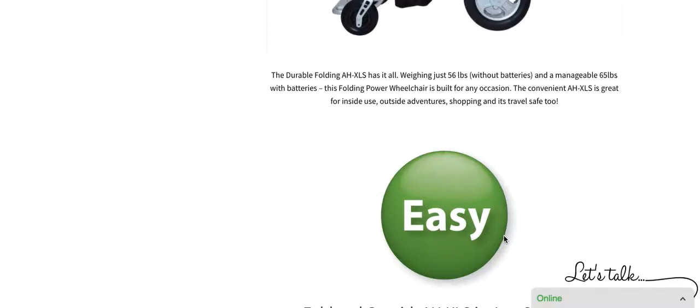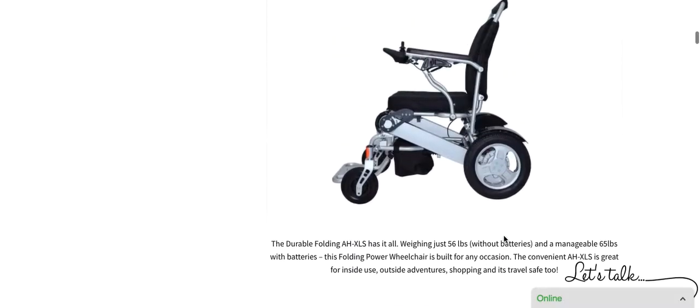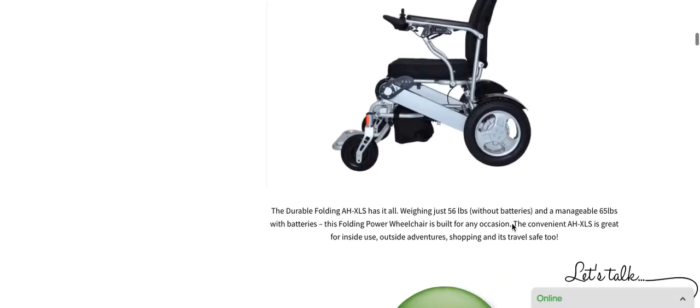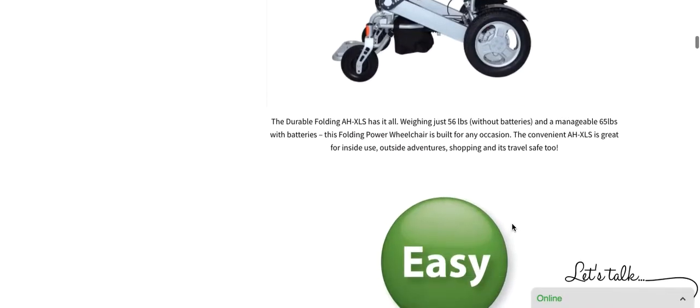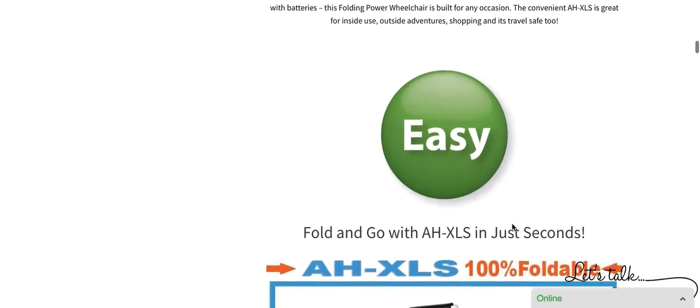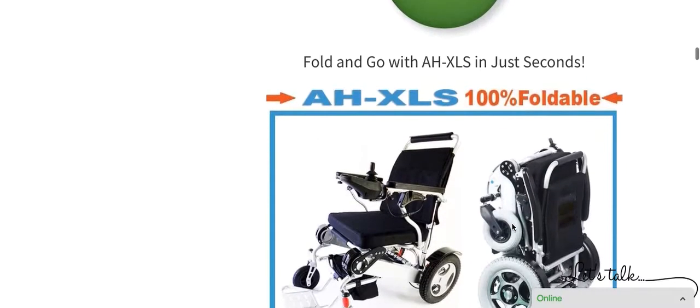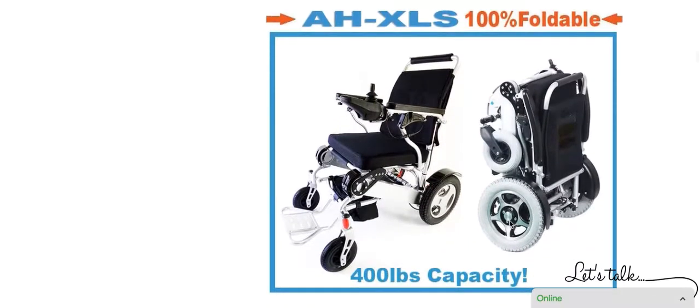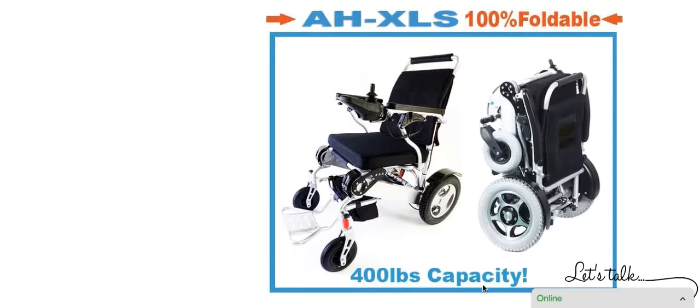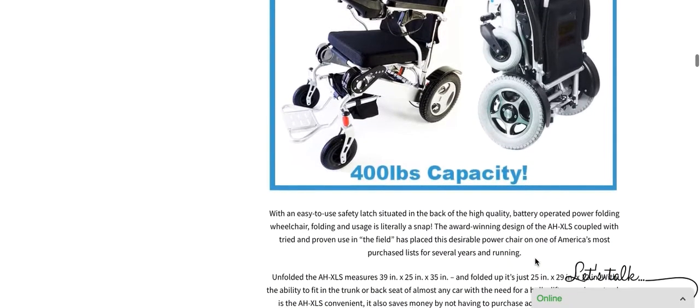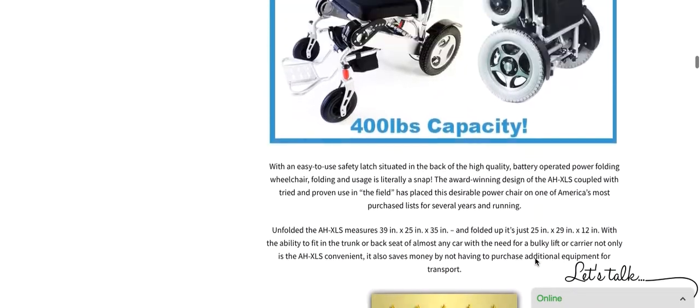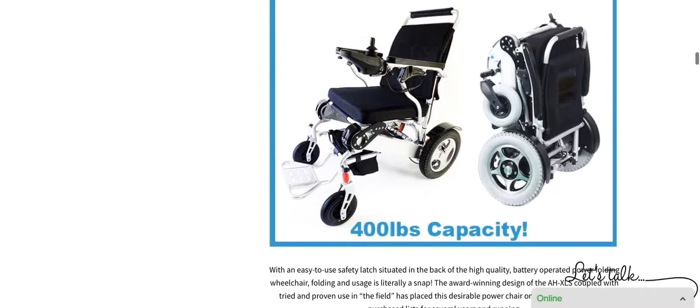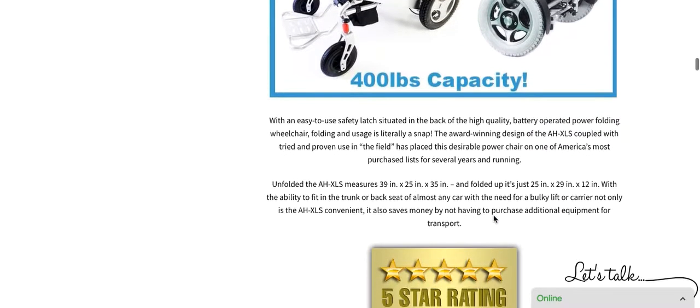Easy to use, folks. The AHXLS is an easy fold-up power chair to use. Literally, it folds within seconds. You can see the chair unfolded. You can see the chair folded. And of course, it has a 400 pound capacity. Please do keep in mind, and let me once again reiterate, the chair has black tires, not gray.